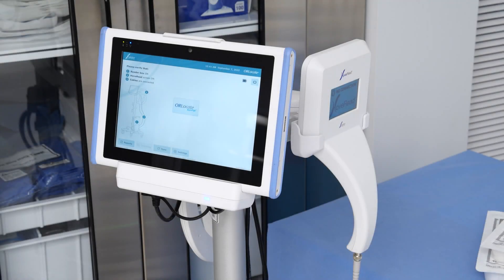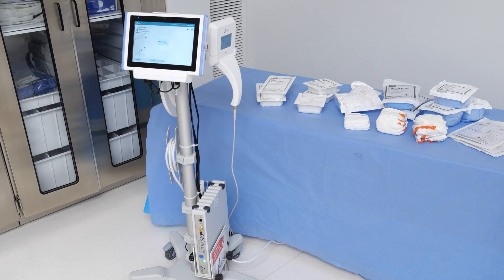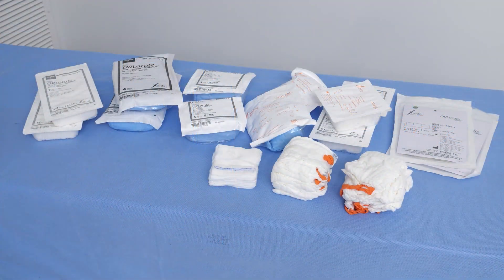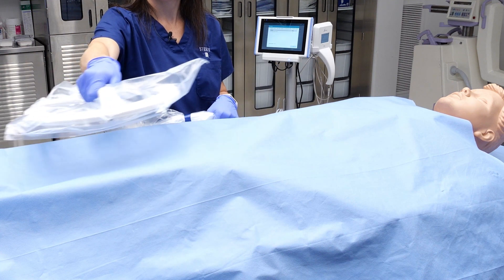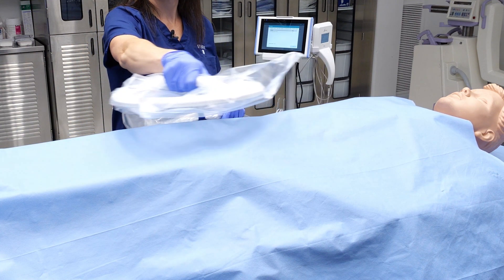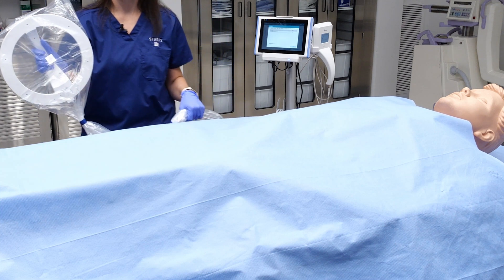The Steris OR Locate solution is indicated for use as an adjunct technology for recording, tracking, and counting RFID-tagged surgical sponges, towels, and other tagged items used during surgical procedures in which counting is required. In addition, OR Locate provides a non-invasive means of detecting retained RFID-tagged surgical sponges, towels, and other tagged items within a surgical site.